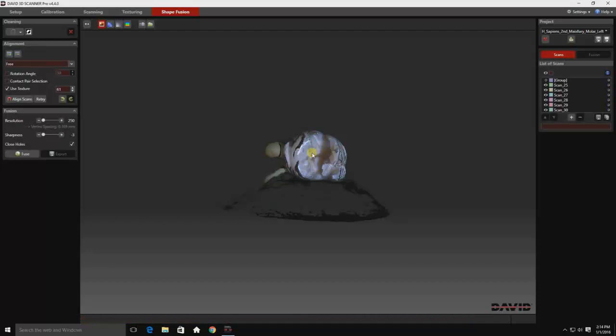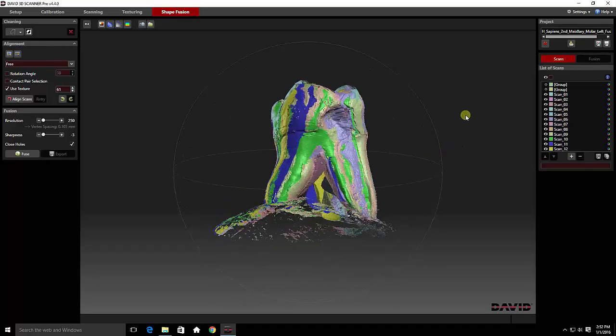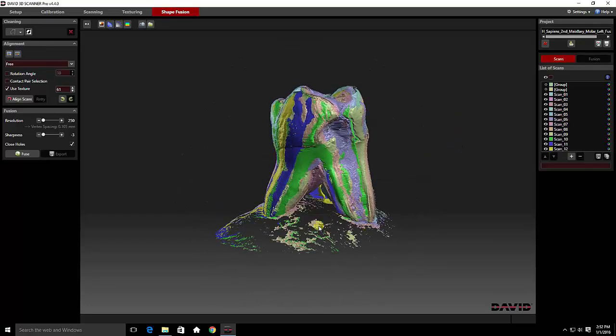Now that we've completed scanning the top portion of the tooth, we'll combine all of the new scans into their own group. I do this by highlighting all the groups, unselecting the one group I already have, right-clicking on the red field, and selecting combined scans.